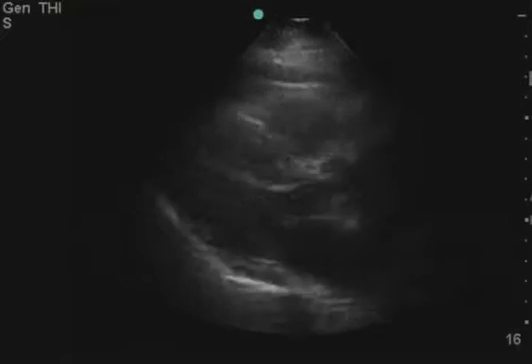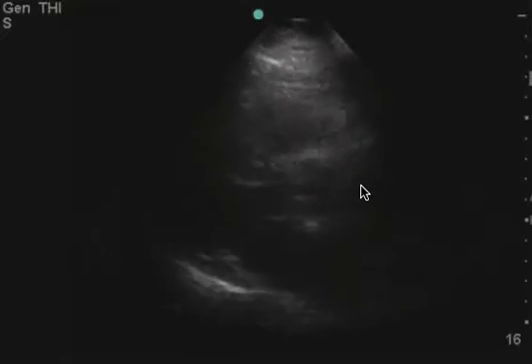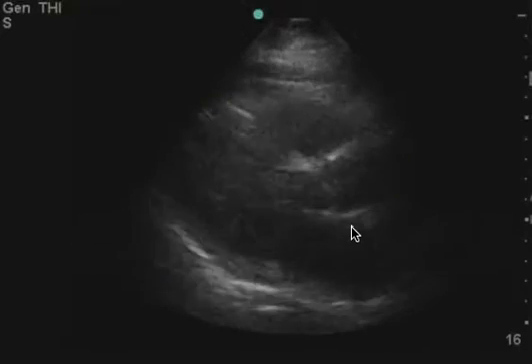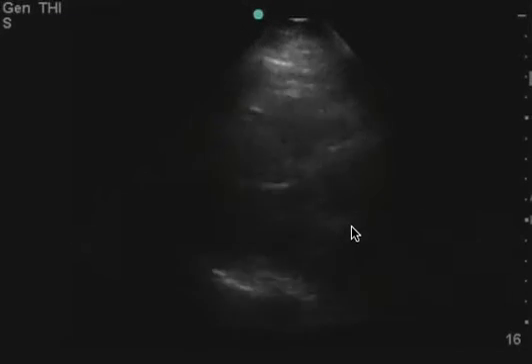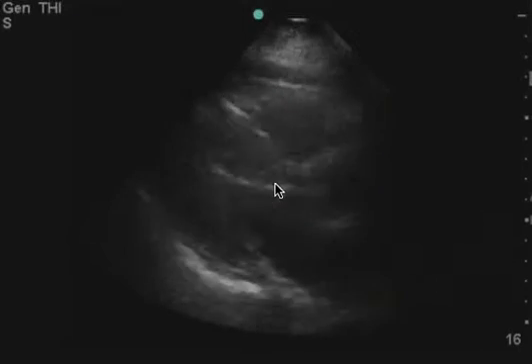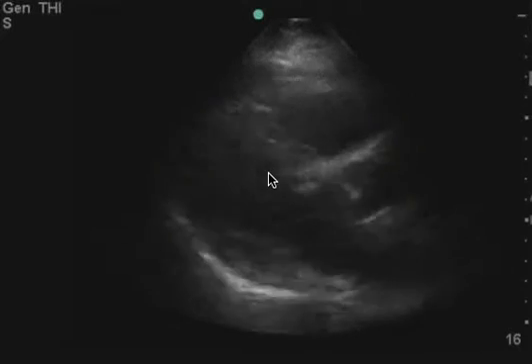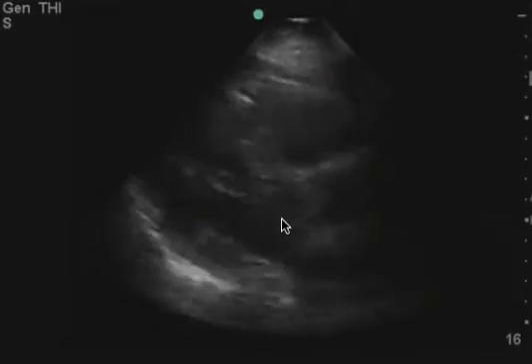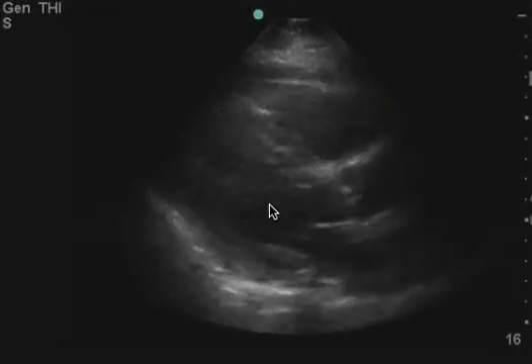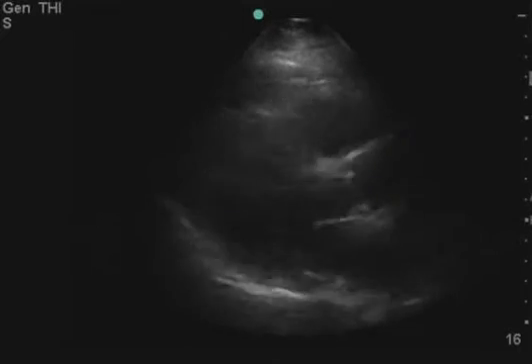This is an 88-year-old patient who comes in with the history of coronary disease and cardiomyopathy, who came in with shortness of breath, questioned CHF versus pneumonia. And here you can see that the ultrasound illustrates a cardiac output and an ejection fraction that is quite hyperdynamic. This valve is hitting the septum, and though the images are grainy, the walls are coming together to the point where this person has a pretty good ejection fraction.